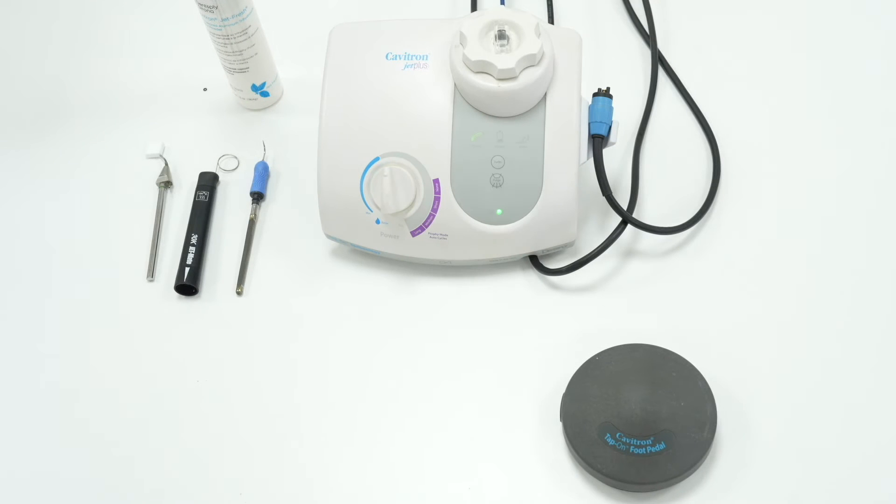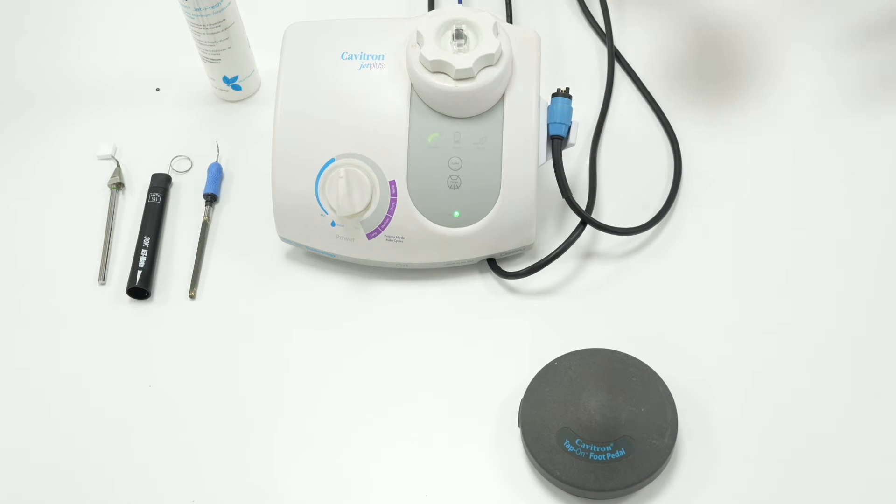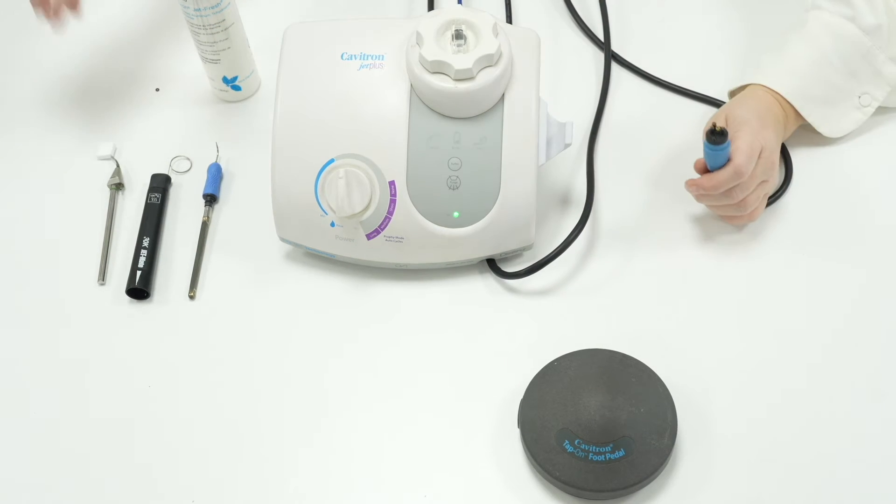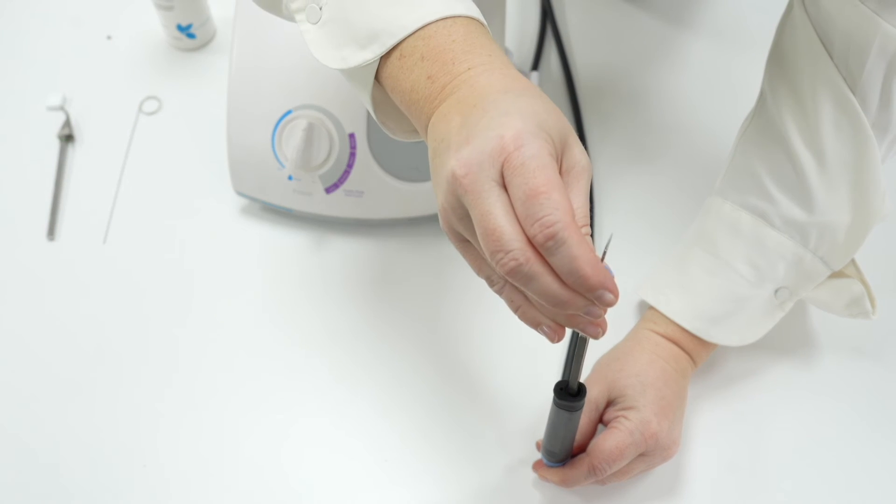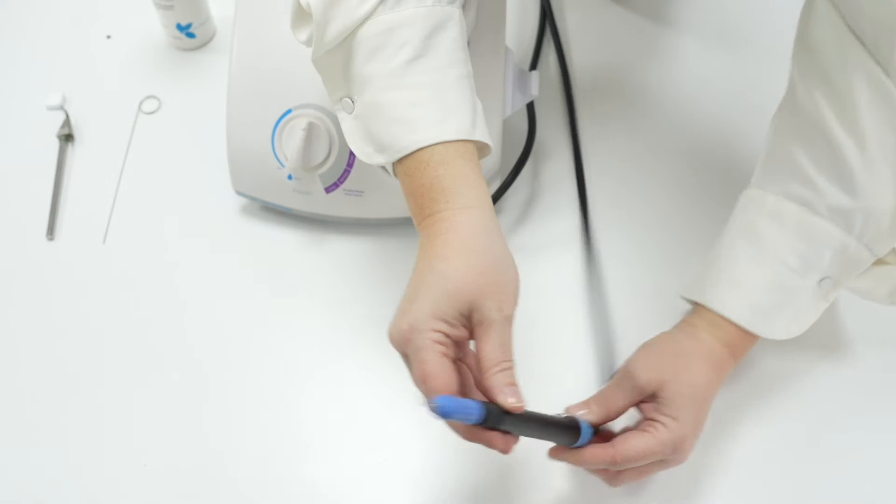So make sure not to remove the insert until the water has stopped, not when the foot pedal is pressed or you may cover your patient in water. When it is time to start scaling before inserting a Cavitron insert, fill up the JetMate while vertical until a bubble of water appears at the top and then drop the insert in.